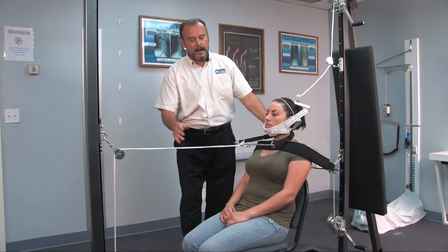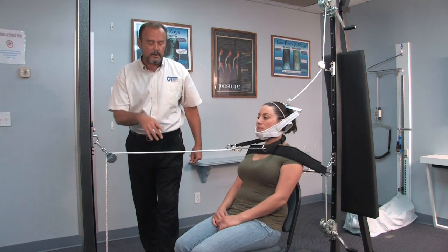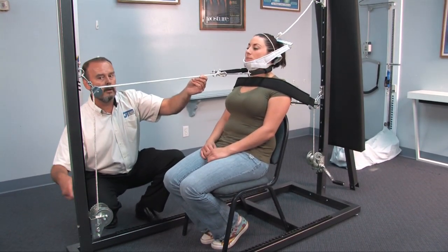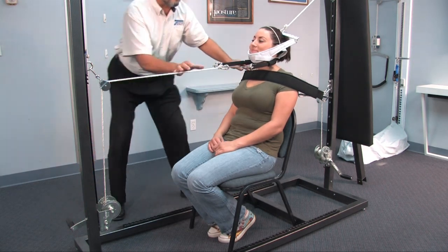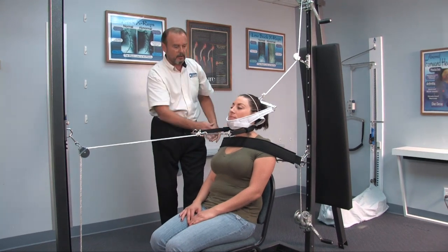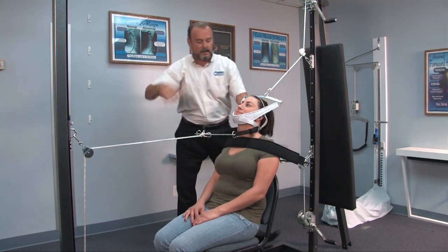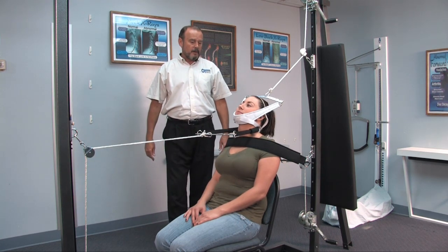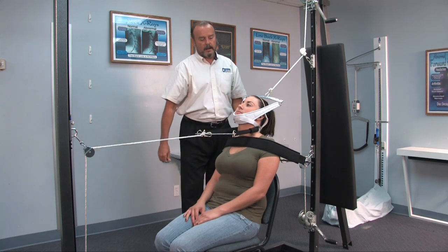You can either guesstimate that, or we also have strain gauges that can go in line here to actually measure the amount of pull you're applying — those are available from Circular Traction Supply and can be used with the unit. Since I don't have those gauges, I'm going to simply pull to her tolerance. We've got a good amount of front pull on there — her ear is pretty much in line with her shoulder, pulling forward — and then I'm simply going to apply a little tension to the back. There's a setup for a Pope type traction, axial extension traction, where we're pulling the upper neck and head backward and up, and pulling the lower to middle neck and upper thoracics forward.